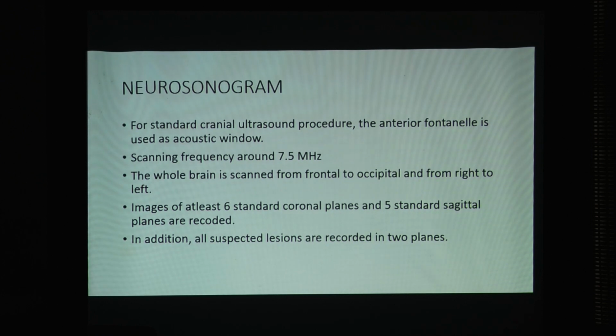Then the neurosonogram, it's a standard procedure now. The anterior fontanelle is used as an acoustic window. Scanning frequency is more than or around 7.5 megahertz. The whole brain is scanned from frontal to occipital region, and from right to left. Then images of at least 6 standard coronal planes and 5 standard sagittal planes are recorded. In addition, all suspected lesions are recorded in 2 planes.